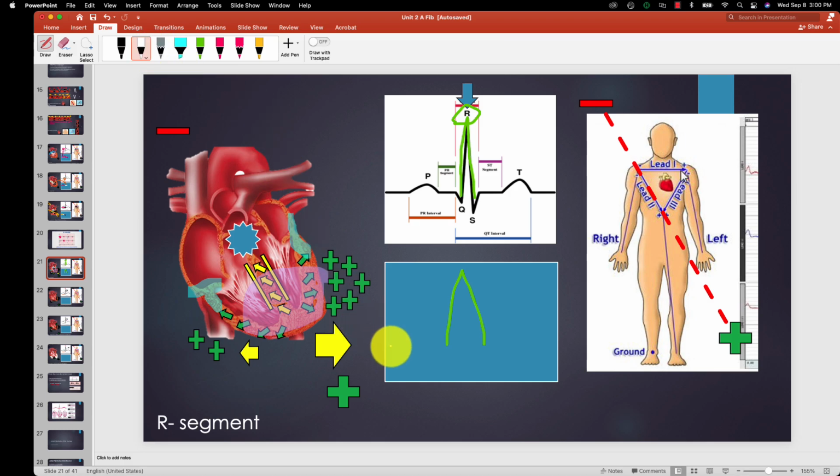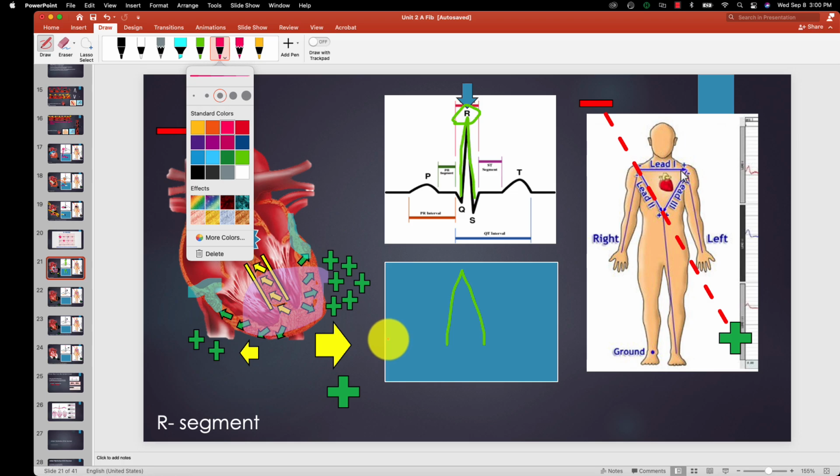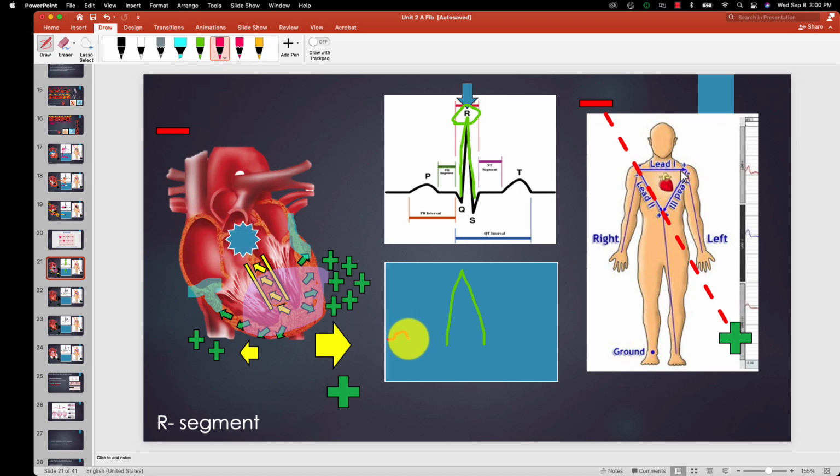And if we just kind of go back and say, okay, well, we started with the P wave. Oh, I'm sorry, P was pink. Let me erase that. We started with the P wave. P was pink. Boop. Atrial firing, atrial contraction. Then we had the PR segment, and that was, hey man, the AV has the message. It's holding it. It's delaying. It's a little bit on the lazy side.